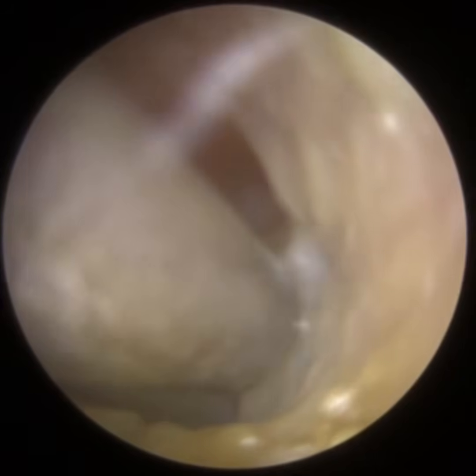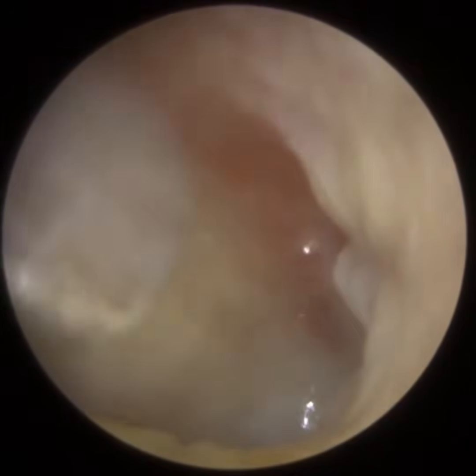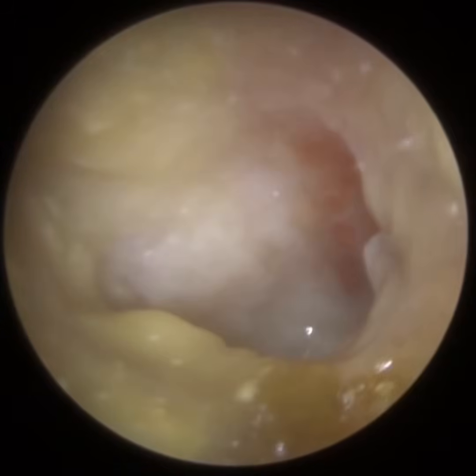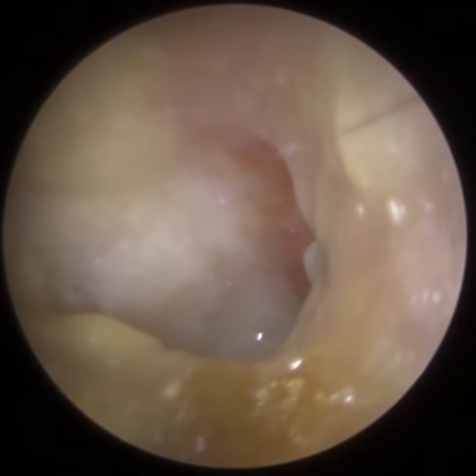So it gives me some reference point to where I am in the ear canal. I'm just slowly going forwards towards the eardrum now. I can see on the right-hand side of the eardrum, the patient has got some granulation tissue. So there we are, the red bubbles.